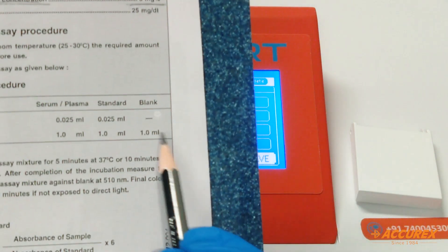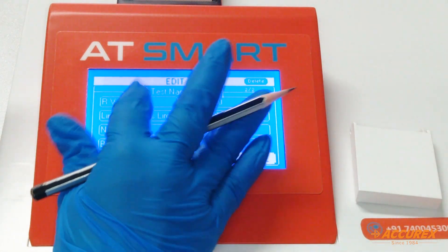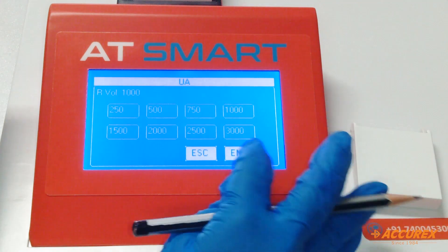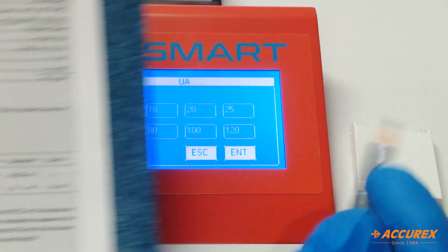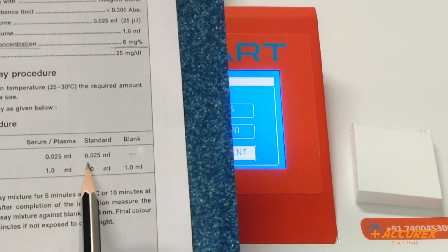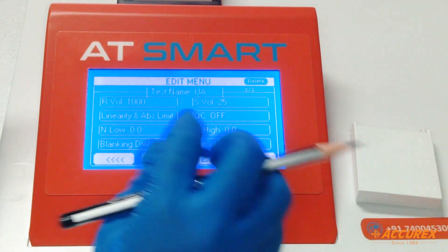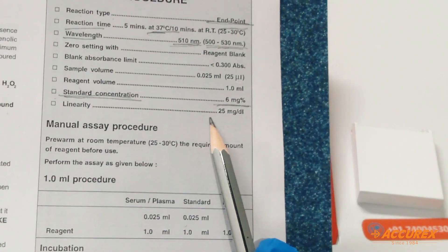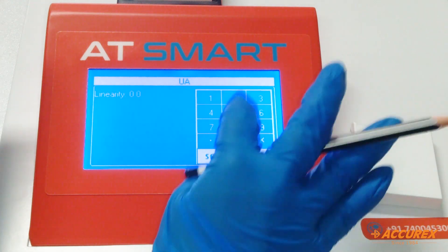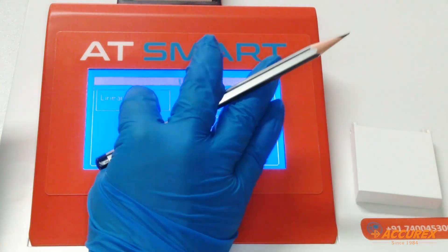Reagent volume is 1 ml, so select 1000 microliter and enter. Sample volume is 25 microliter, so select 25 and enter. Linearity of uric acid is 25 mg per dL, so type 25 and enter.